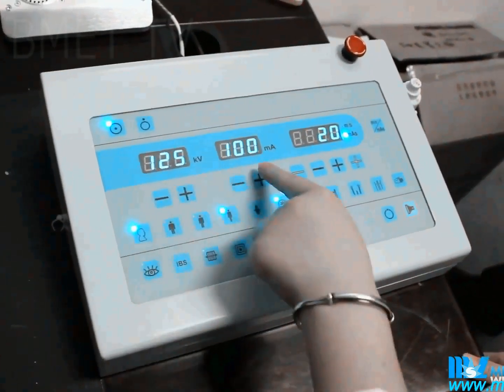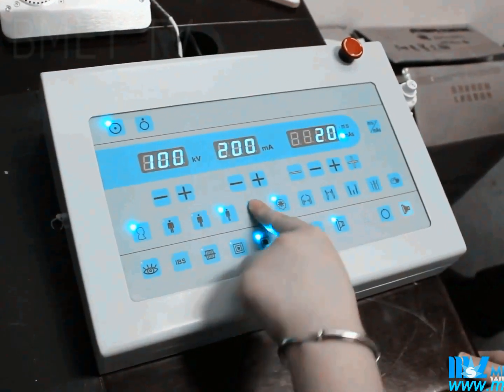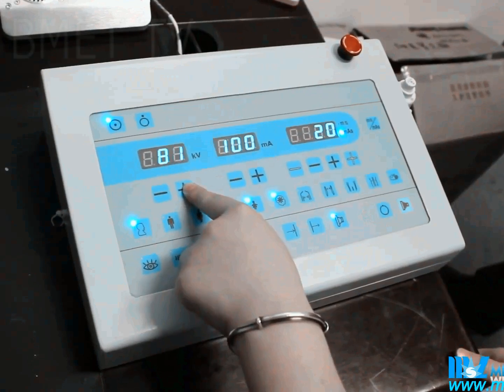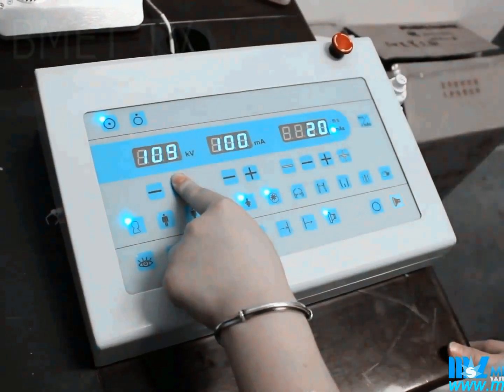In early and basic X-ray equipment, the applied voltage varies cyclically with 1, 2, or more pulses per mains AC power cycle. One standard way to measure pulsating DC is its peak amplitude, hence kVp. Most modern X-ray generators apply a constant potential across the X-ray tube. In such systems, the kVp and the steady-state kV are identical.